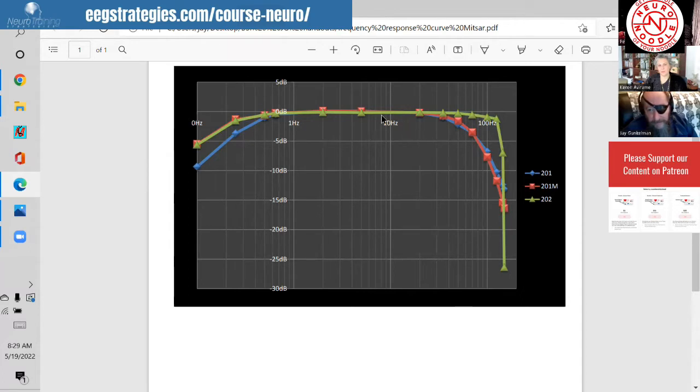It'd basically have dropped off fairly quickly here, not gone out to 70, which is a medical grade amplifier. And the amps are relatively linear through the pass band. They don't overinflate and then underinflate. They're fairly accurate in their estimation.